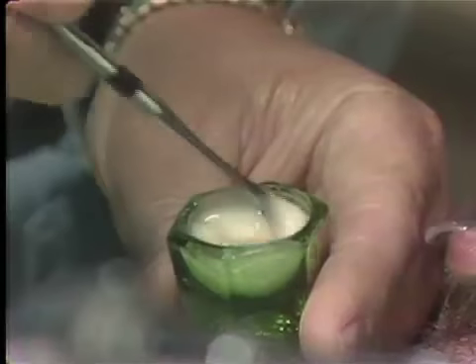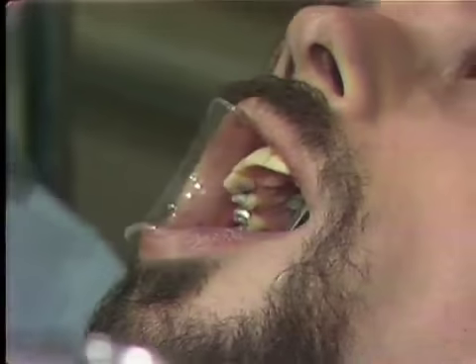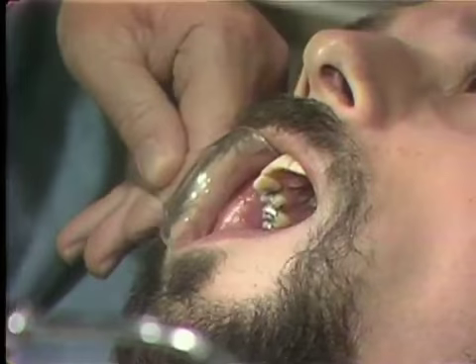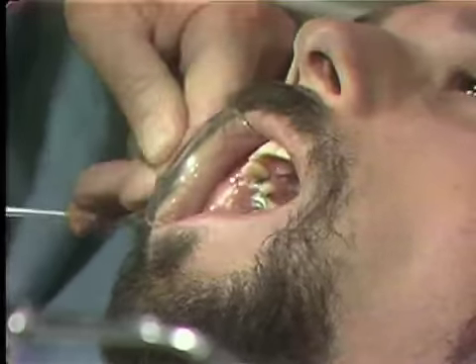To get real accurate margins, you should take Duralay and paint around the marginal areas of the teeth. So while that Duralay is getting a little bit of body, we will take the Duralay on the brush.